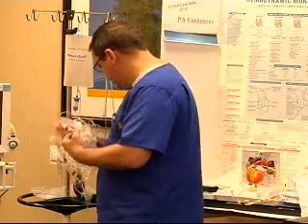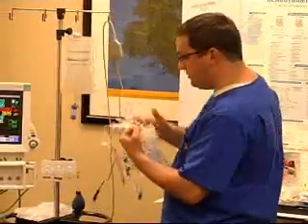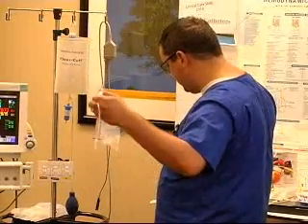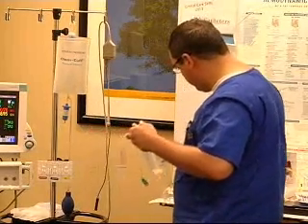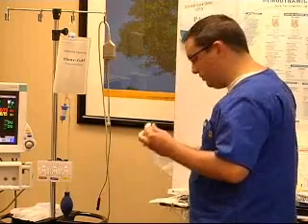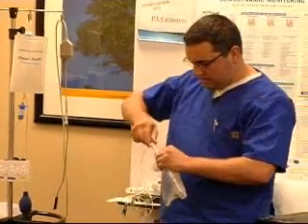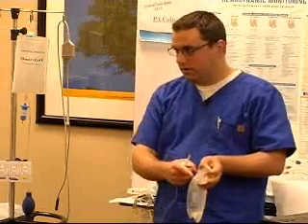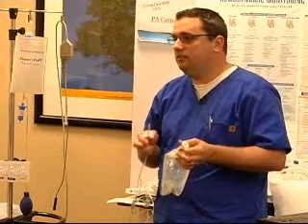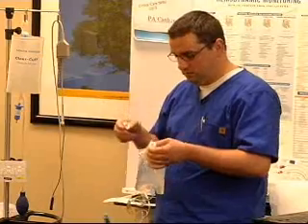Now I brought this up so that you can kind of see. You're also going to need the pressure bag system, or pressure bag as well. So there's a couple different ways you can get the air out of this 500 cc bag. Some people prefer the needle aspiration through this port right here. That's fine as long as whatever you're doing is maintaining sterility in your process so that you don't introduce anything into this closed system.